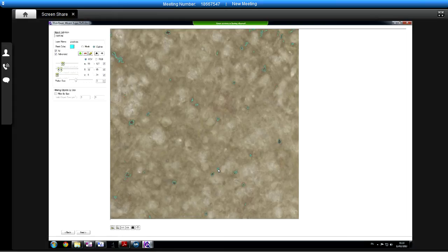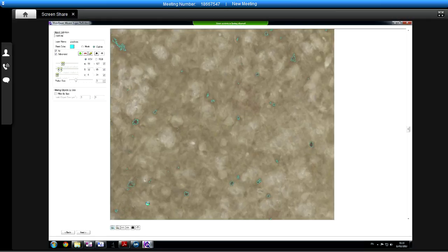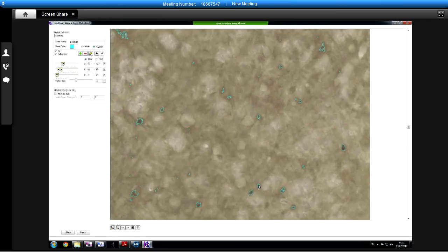So it's here, isn't it? Yeah. Like I said, it's really tricky. Yeah, it's quite difficult, isn't it? It's brown on brown, isn't it? So, okay, so we look around now. What I'd say, yes, yes.